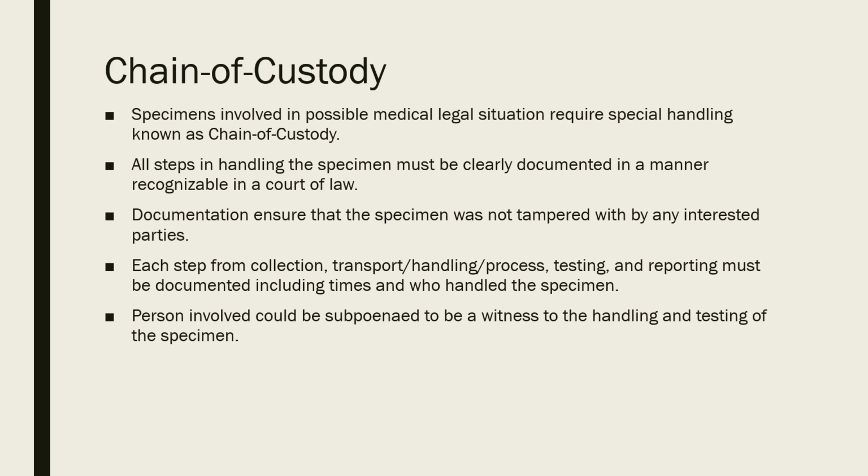So if you go, for example, for a job that requires a drug screen test as part of that pre-employment screening, then that drug screen is going to go through a chain of custody. And this is so that it is tracked from the time it's collected. It has a seal on it. That seal is not to be breached, because if it is, then that sample is considered invalid.